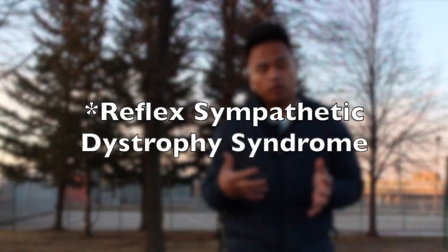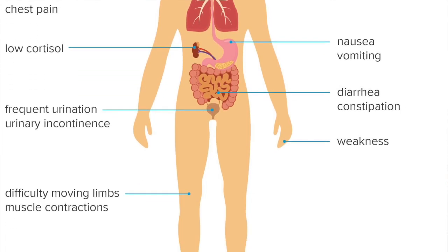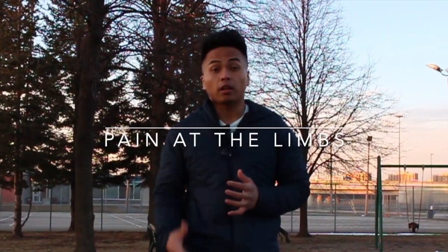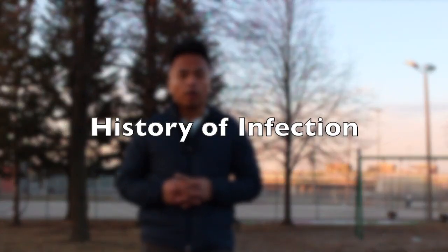Like any other kind of medical procedure, joint injections pose some contraindications for certain types of patients. Such contraindications may include sympathetic dystrophy syndrome, which is a condition wherein any aspiration done in the body causes extreme pain in the limbs of patients that have experienced stroke before. Any allergies to medication that we may be introducing, such as lidocaine, hydrocortisone, or the contrast media itself. Patients with a history of infection are at high risk of further infection when we aspirate the body.